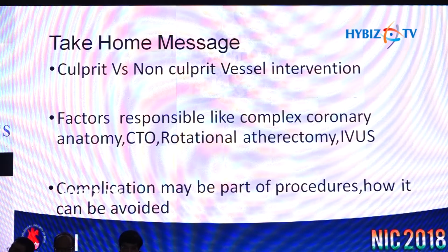Come to your case. What was the reason in your case? In theory, we all know the reasons. In my case, probably 2 things which I observed: I had not prepared the bed properly, and second, oversizing of the stent. Definitely oversizing is the reason. In this patient, you see the first shot after inflation, probably exposed. How much was the stent used? 3.5? No, sir, 2.75, in the circumflex.